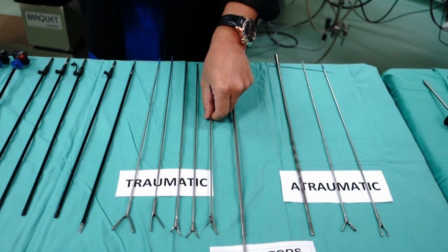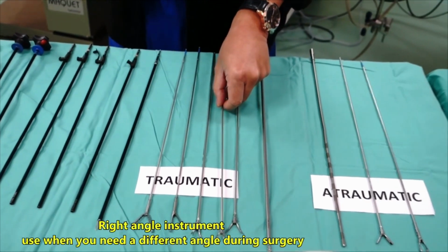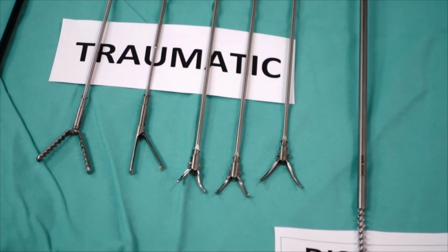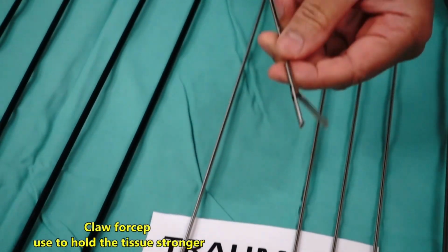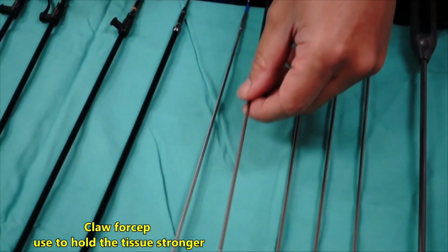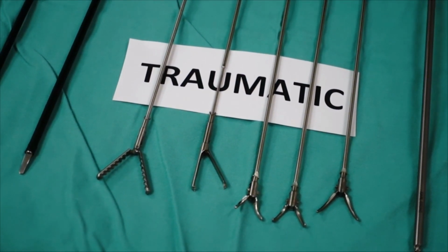The traumatic instruments are quite specific to a specific function. Now, if you want to peel off a cyst wall, probably you would use a pointed end Maryland. And if you need a different angle, probably you use a right angle to help you peel off the cyst wall. So these are specific functions. Now if you want to hold a tissue harder, or stronger, you can use a claw forceps. Sometimes the dissection needs a lot more holding power, so you can use that.